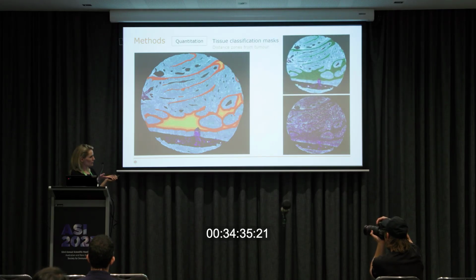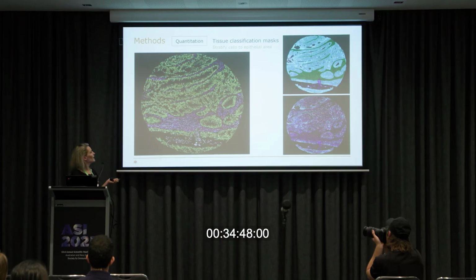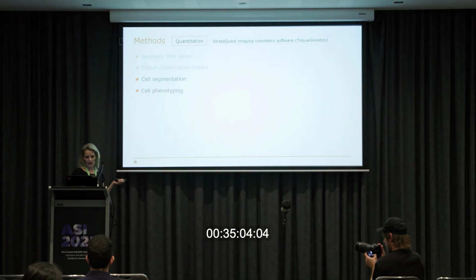And then Rupert briefly showed us the distance masks as well. We can choose to create these distance bands and look for the cells that exist within those bands and distances from the epithelium. And this is the reason that we do this as well: in yellow here are all the nuclei that are on that epithelial mask, and in blue all the nuclei that aren't. So we can look at the number of cells in the tumour versus the number of cells in the stroma, and also we could do that in those distance bands as well.